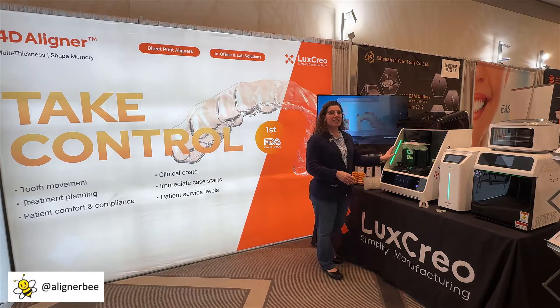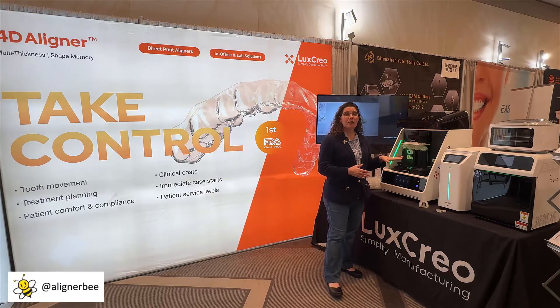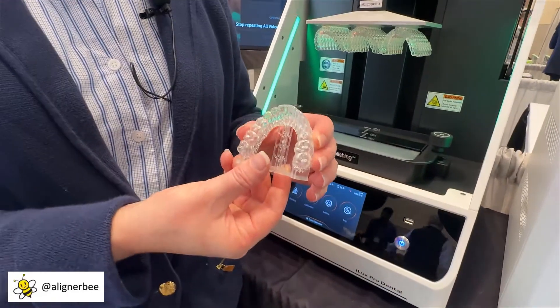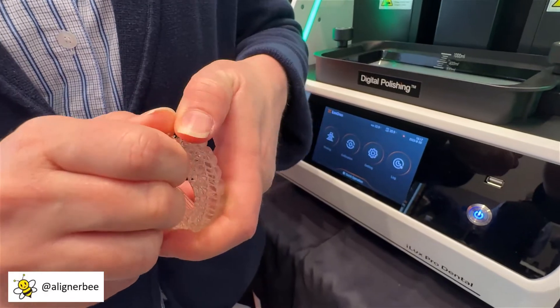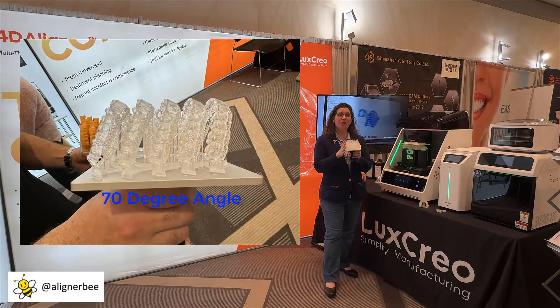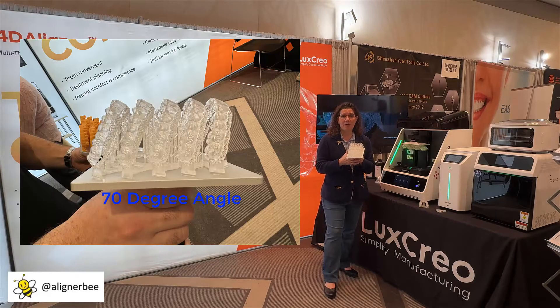We can see that they have their own proprietary 3D printer where we're able to 3D print the clear aligners to the build platform using supports. These supports are designed to peel away and then to have minimal polishing at the edges of the clear aligner. One of the unique things that we can see here with this printer is these aligners are designed to print vertically, however instead of straight vertically they print at approximately a 70 degree angle, and this I have been told is for the accuracy of the prints.